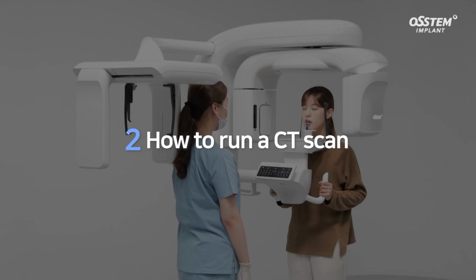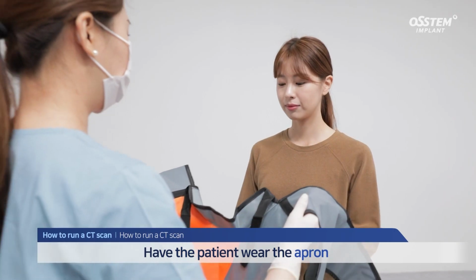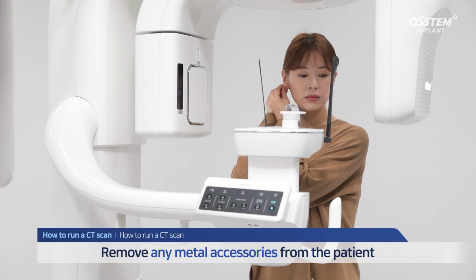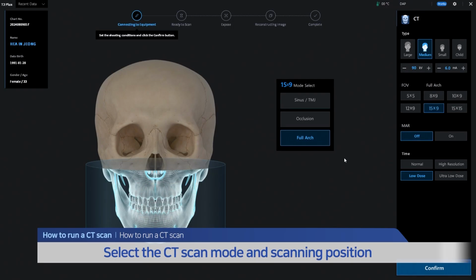Second, let's see how to run a CT scan. Before running the CT scan, mount the chin rest and bite. Have the patient wear the apron to reduce their radiation exposure. Remove any metal accessories from the patient and place them on the cradle. Let's look at the options for CT scan and scanning position.